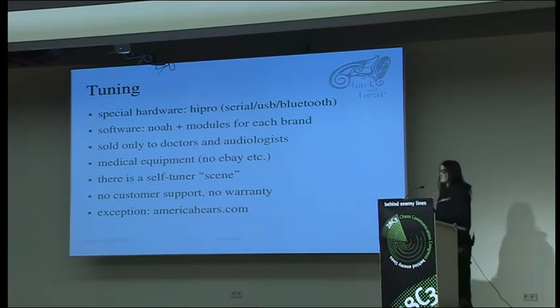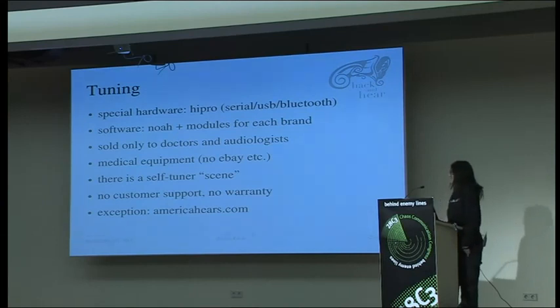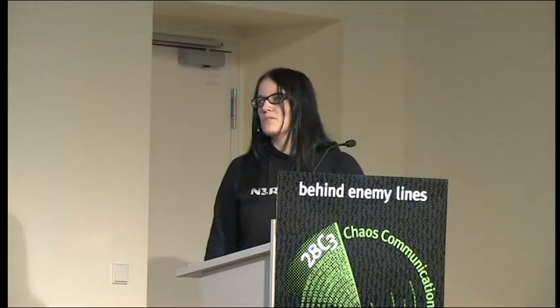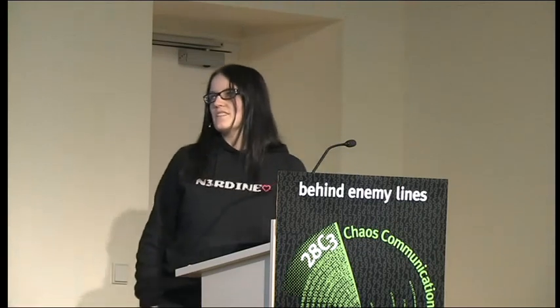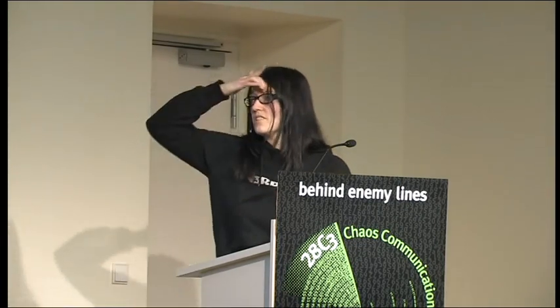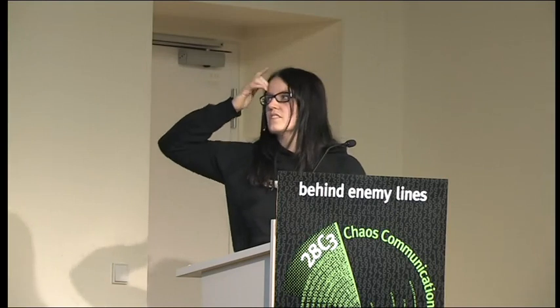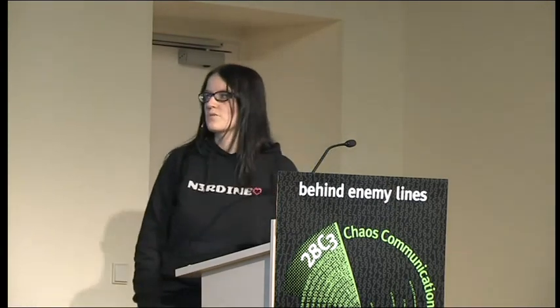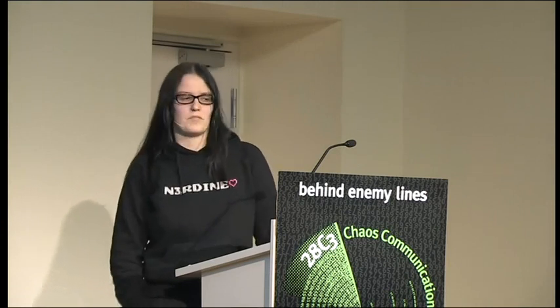So there you have to use other channels. There's like a black market for it. It's kind of hard to put a price on that, but I've seen offers for the hardware, which is called Hi Pro, and there are different versions for serial, USB or Bluetooth, and it starts with a couple of hundred euros.